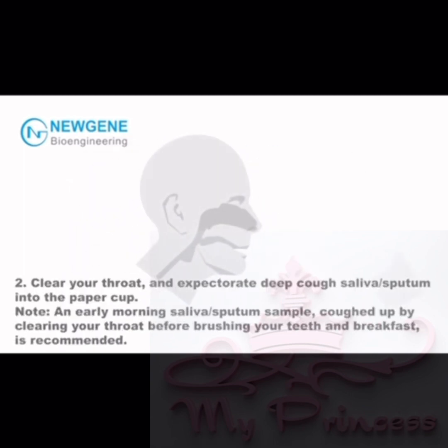Step 2: Clear your throat and expectorate — deep cough saliva and/or sputum into the paper cup. Note: An early morning saliva and/or sputum sample coughed up by clearing your throat before brushing your teeth and breakfast is recommended.